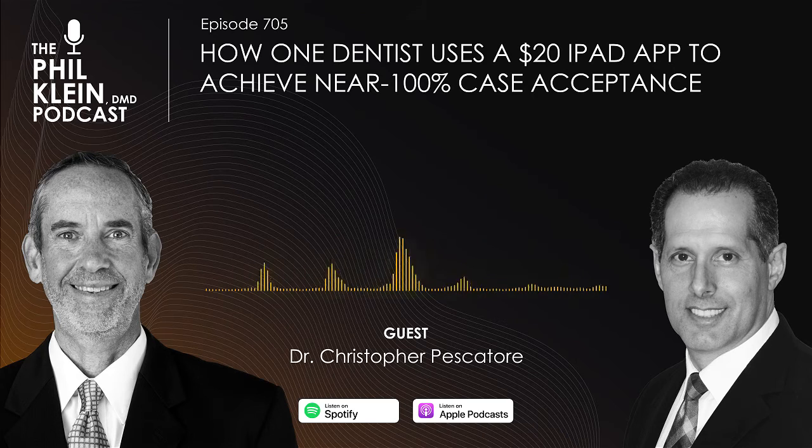When I just take away what I need to take away and add, digitally we're doing this old lost wax technique because it's the most accurate. Digital wax ups come back, and a lot of the times there is just a lot of excess material and work I have to do that I never had to do before. So that's another reason why I decided to take control digitally myself.